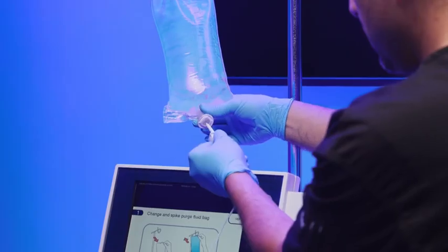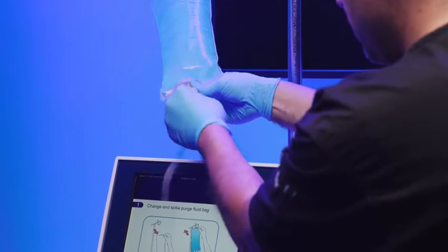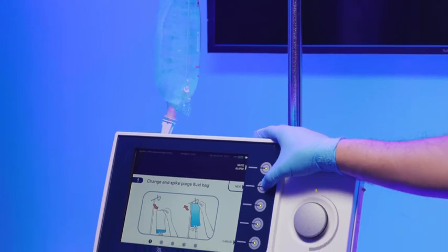Replace the purge fluid bag by unspiking the original fluid bag and spiking the new purge fluid bag. Once completed, select next.